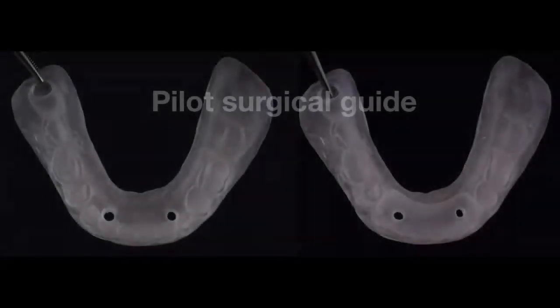So you can see now we've created in the area of 22 and 27 these pilot surgical holes onto this clear denture. Not only do we create these surgical holes, but then we flatten, we remove from canine to canine, we make everything nice and flat. And this is going to help give us better visualization of the pilot drill when we're making our bleeding points and when we're making our pilot drill within the bone, so that now we know exactly where we want to locate those implants.